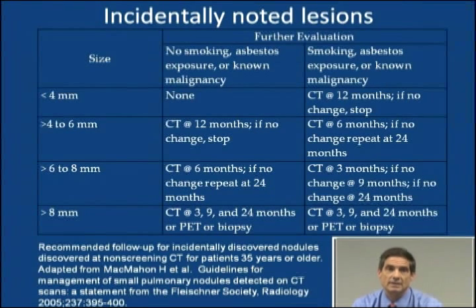Now, unfortunately, the exact follow-up pattern of when you do that examination in follow-up of an incidentally discovered nodule varies in a way that's complex and difficult to memorize. But this table, which is pretty widely publicized and from the eminent Fleischner Society, and was published in many other places in addition to Radiology in 2005, which is our main journal, gives you the following rules.